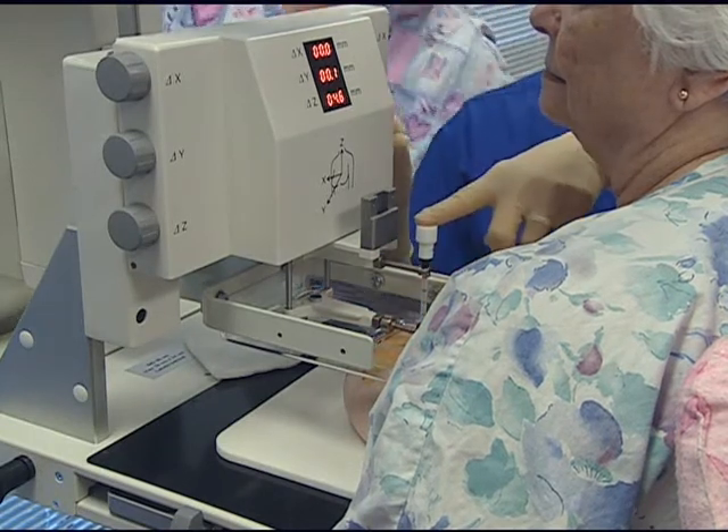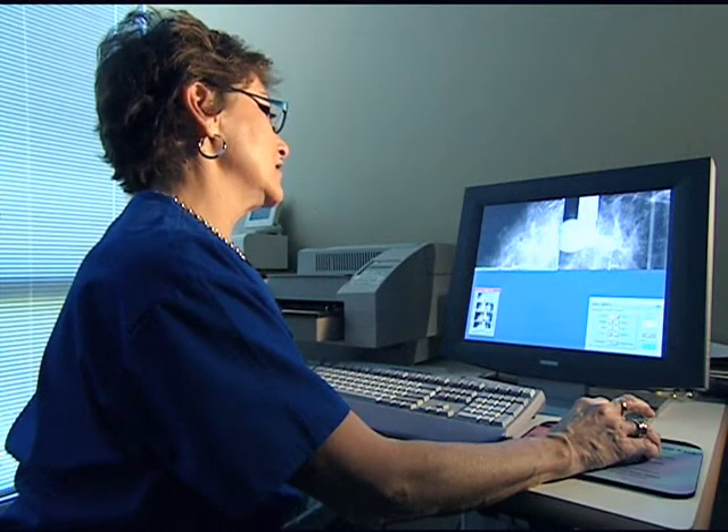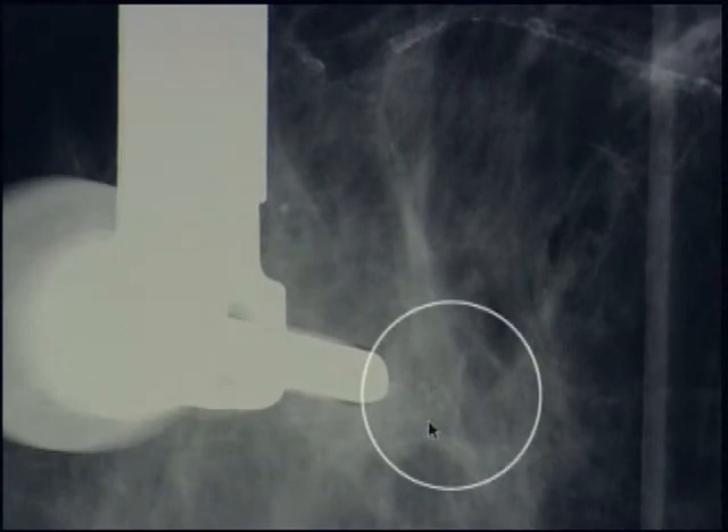Now I'm looking at my coordinates and I like to take this down to zero. Let's take a stereo pair now. We have just taken the post-placement pre-biopsy film. It's a little less easy to see the calcifications because we've already injected xylocaine, so it's grayed out a little bit, but they're right here. We're going to be in excellent position once the instrument is deployed — it will come out right to here, so perfect placement.